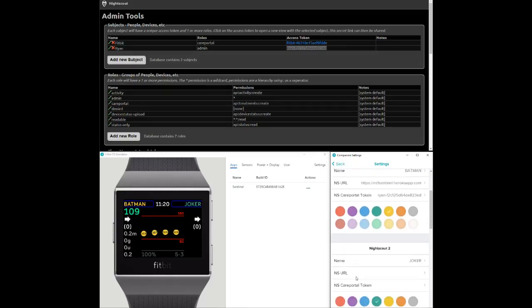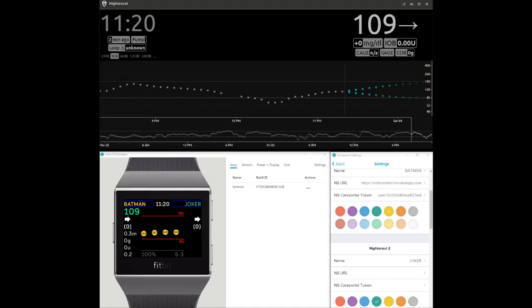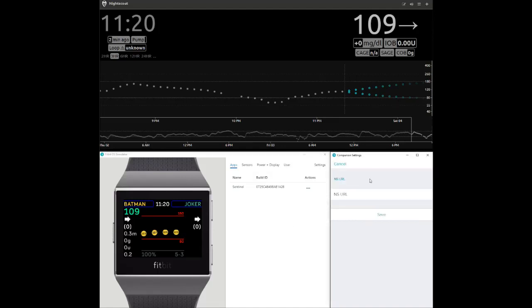Next, enter the name, NightScout URL, and care portal token for the second NightScout account being monitored.